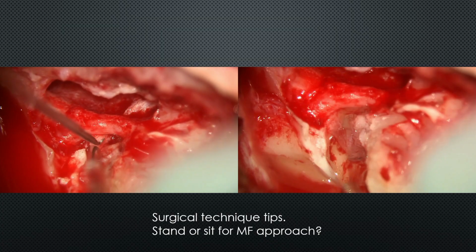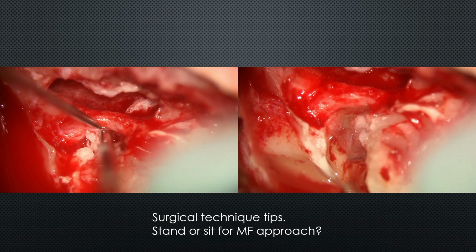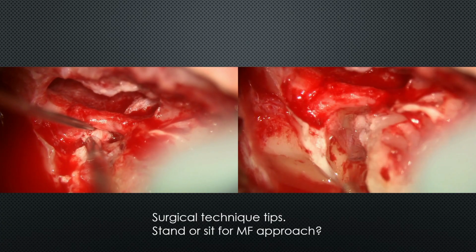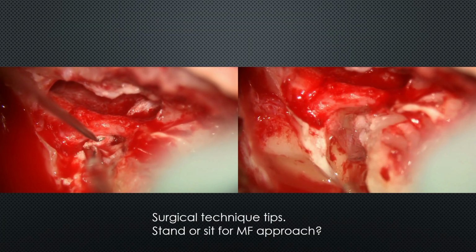I like an annulus elevator. Sometimes a nerve stimulator, just to torture everybody in the OR, can be nice, that little blunt tip of the Prass probe. Sharp dissection, I think, is okay. I think sometimes you can actually use directional irrigation and kind of hydrodissect, or at least clean off some of the blood and make things easier to see.